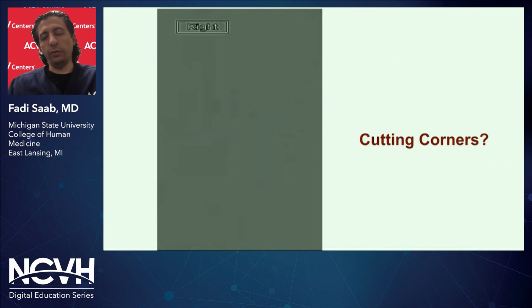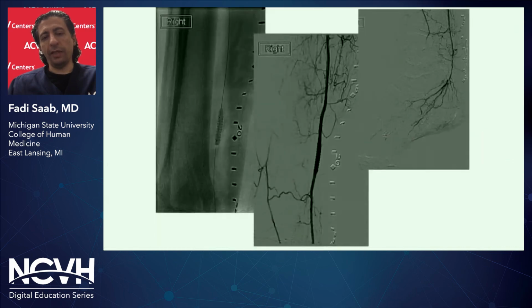And we had to place a covered stent at that location. The patient did okay. And this is actually before the days of using precision sheaths or slender sheaths for those patients. I think this is the only complication that I can remember in my practice, at least, where I had to place a covered stent, and I think it was related to sheathless access in that situation.